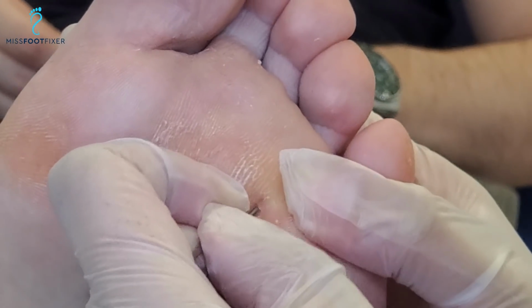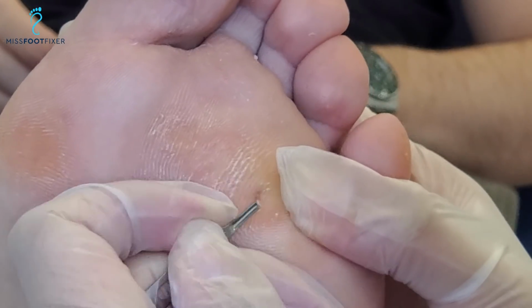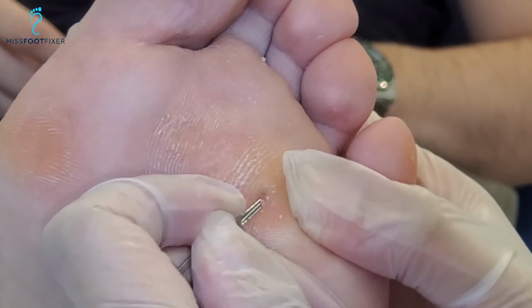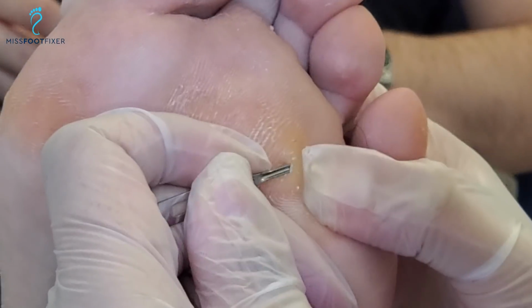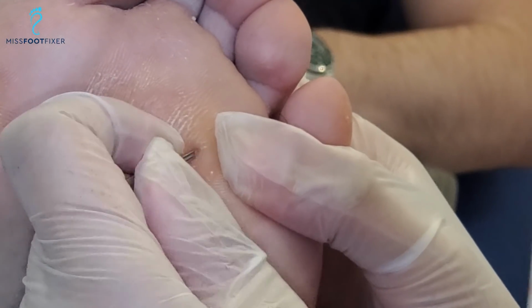Stephanie, is this really zoomed in? Mm-hmm. Thank you. I'm going further in and trying to dig everything out. Seems as it is. It's good. Yeah, you can feel the base now, right? That's good. We'll do another metal drill piece because I'm going to drill this. This is small.